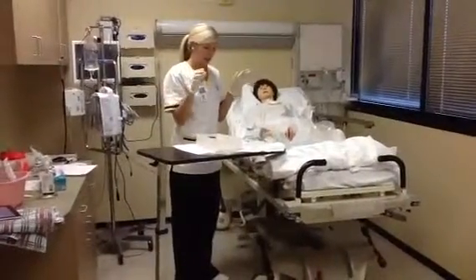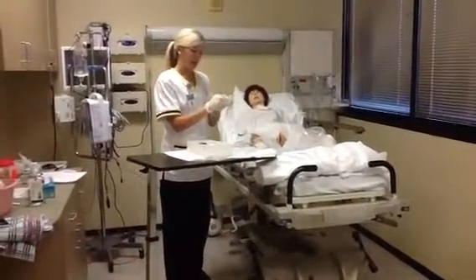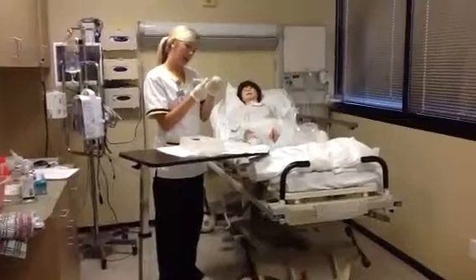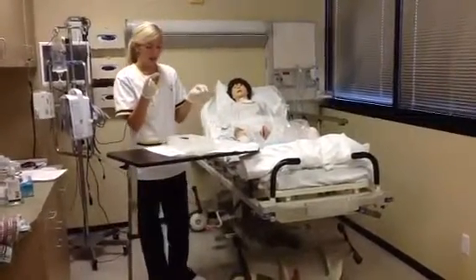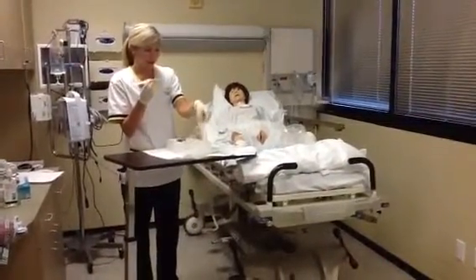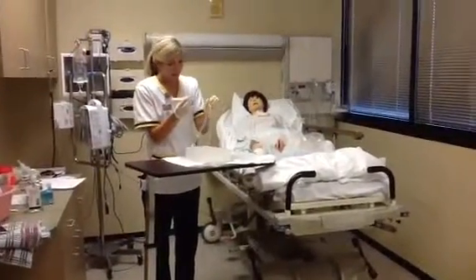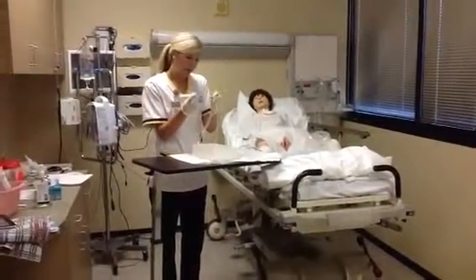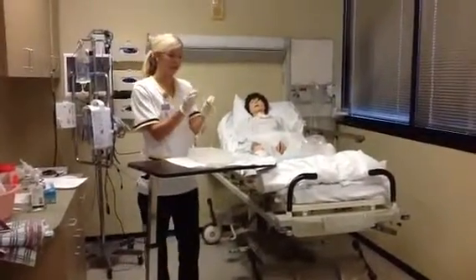So now I'm going to grab my sterile solution, and I see that it is 10 milliliters. Take the lid off, and I'm going to reach in for my catheter, and I'm going to check this little green thing that says that this balloon can hold 5 to 10 milliliters, which is what's in my syringe.